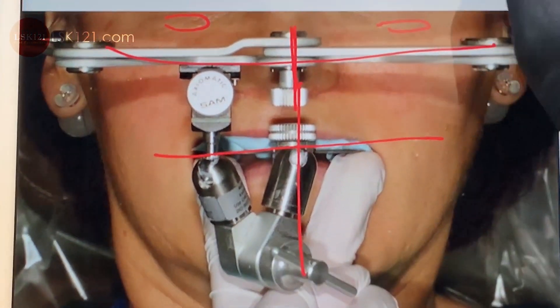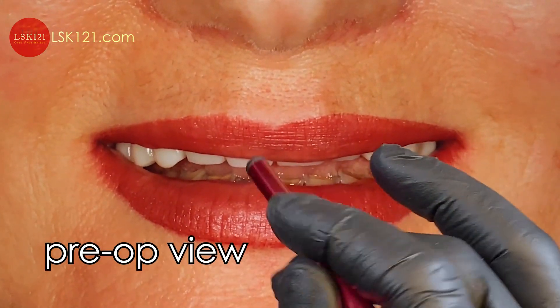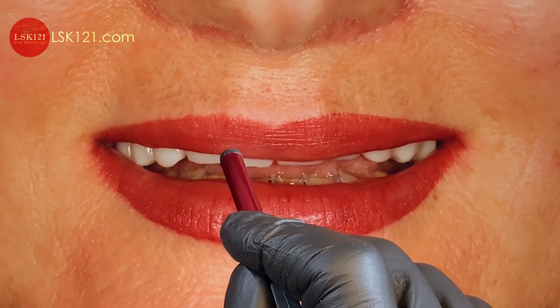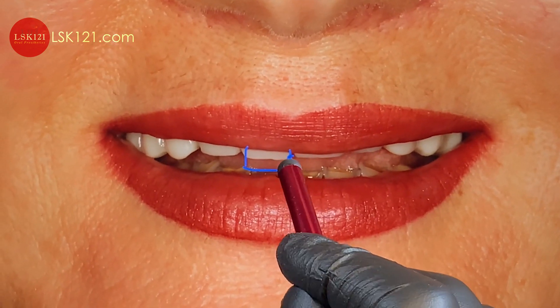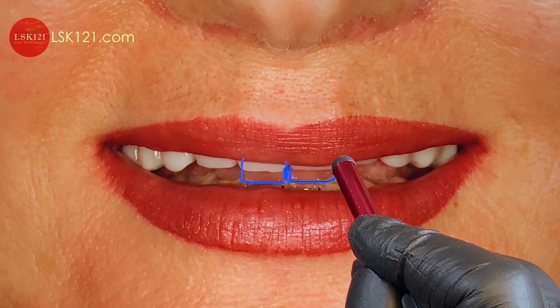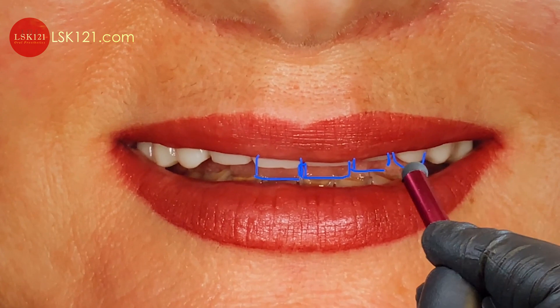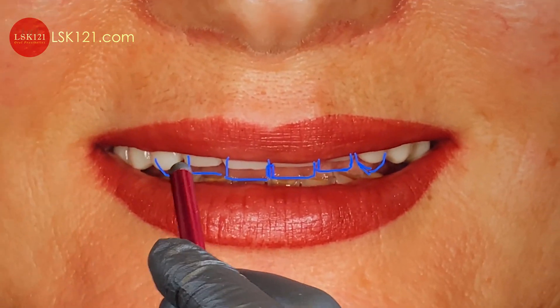We could make the mounting with the SAM articulator. This is the pre-op view — we have to increase the tooth showing, about five millimeters. The literature says whenever at rest position, we try to make it six to four to six millimeters; we have to increase it.